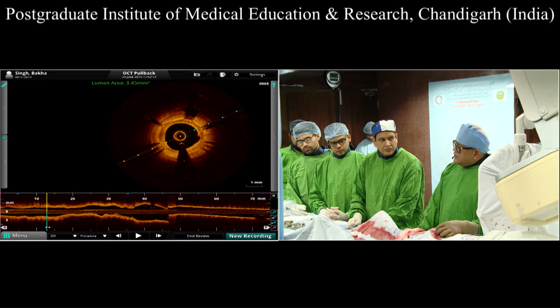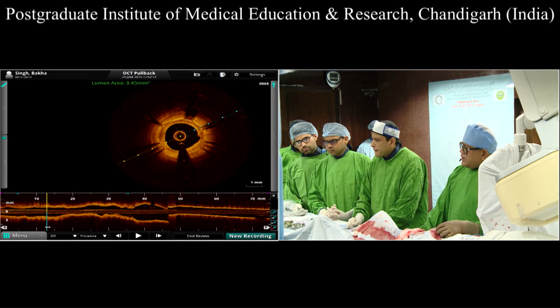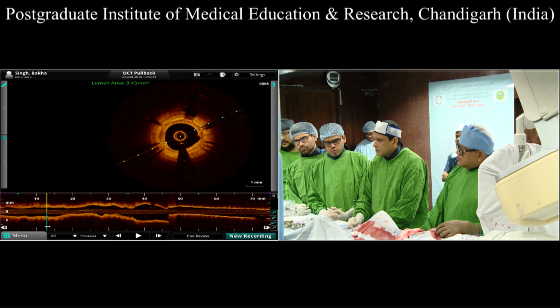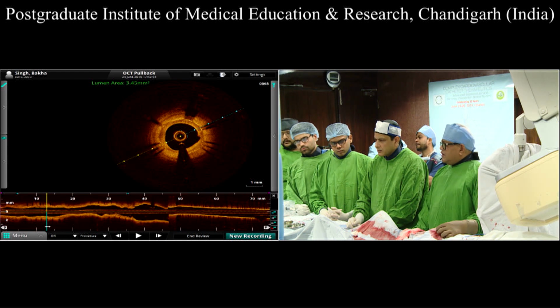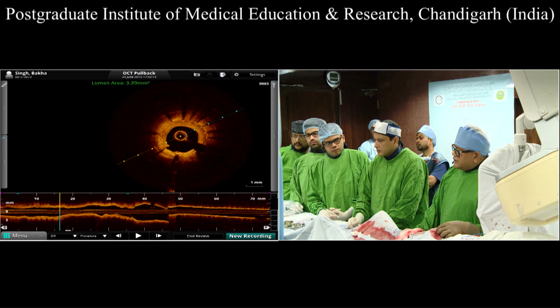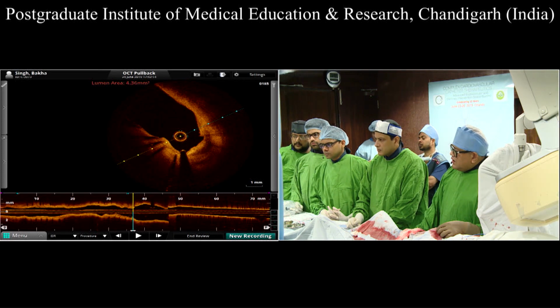And regarding the reason for in-stent restenosis, as the size of the stent was 2.75 and the EEL diameter is coming to be 3.25 to 3.45, basically it's an undersized stent, and as you rightly commented, there is a part of in-segment restenosis at the ostium, secondary to the process of neointimal hyperplasia.